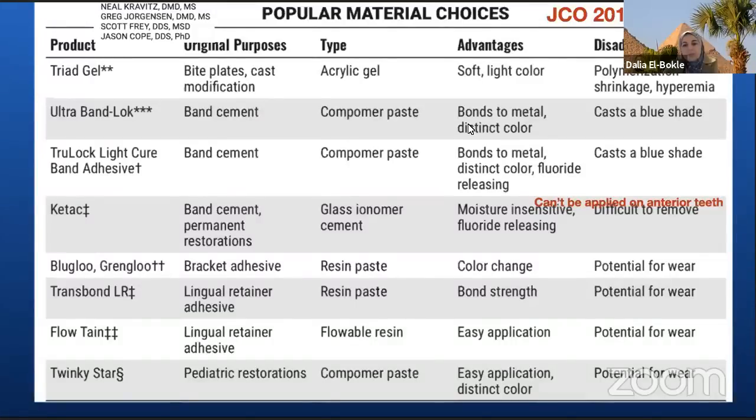The only problem is it's difficult to remove, and it cannot be applied to the anterior teeth. However, it's moisture insensitive, it's fluoride releasing, it's more resilient than the other types. There is no etchant required, and I can usually shape it with a wet cotton bud. And it's relatively inexpensive as well. But you can try all these different kinds, and whatever kind you prefer to use or is readily available where you are, you can use it.